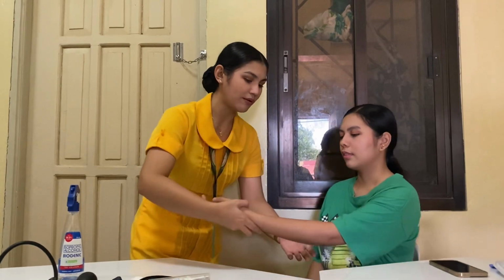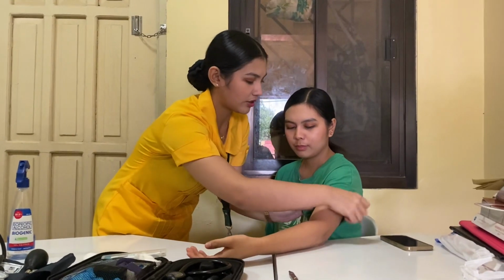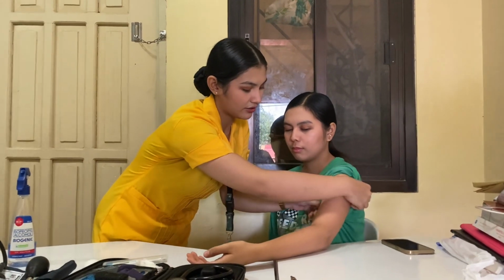And then we're going to provide for the client's privacy before and after the procedure. And then we're going to locate the brachial artery to assess the client's blood pressure and then conduct the blood pressure assessment. So I'm going to measure your blood pressure now, ma'am. Kindly move towards the table.